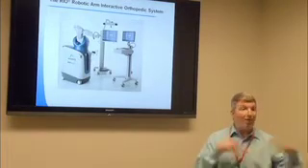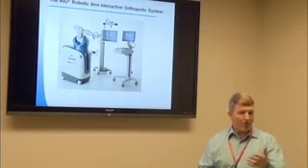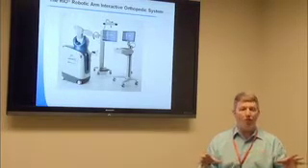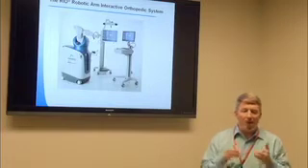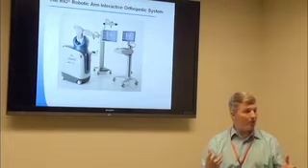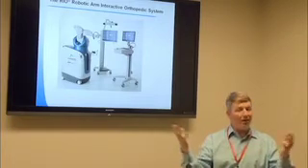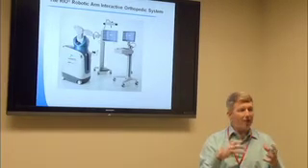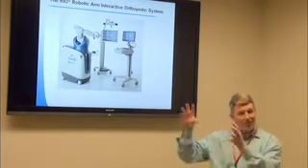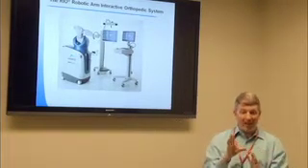So it gives us a significant advantage with our anatomy and the component positioning, because what we've seen over the years, like I said, this particular surgery has been around a long time. Doing partial knee replacements is not anything new. It's just that how we've done them in the past has often led to early failures because we can't get the components just the way they need to be relative to an individual's anatomy. Sometimes we get lucky and we get it in the right spot and they do great. But sometimes if you don't get the position just right, they can fail at a very early stage, within 5 years sometimes. So what this technology allows us to do is get that within 98.8% accurate.